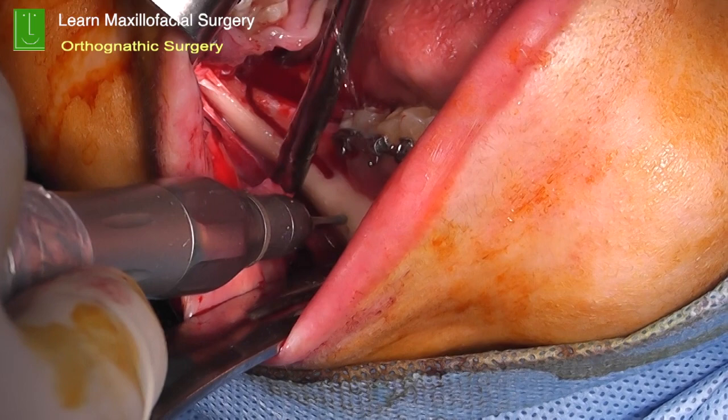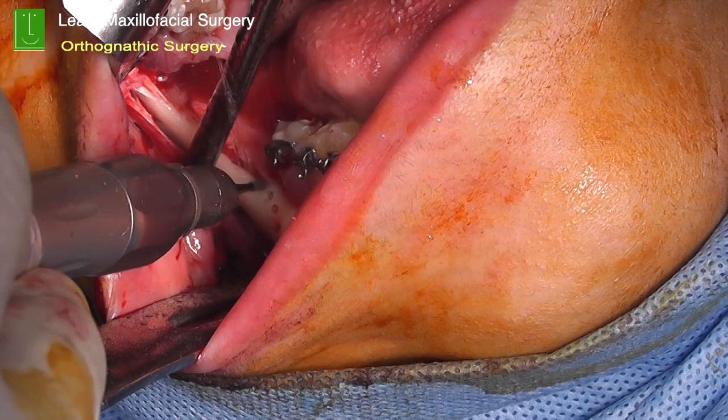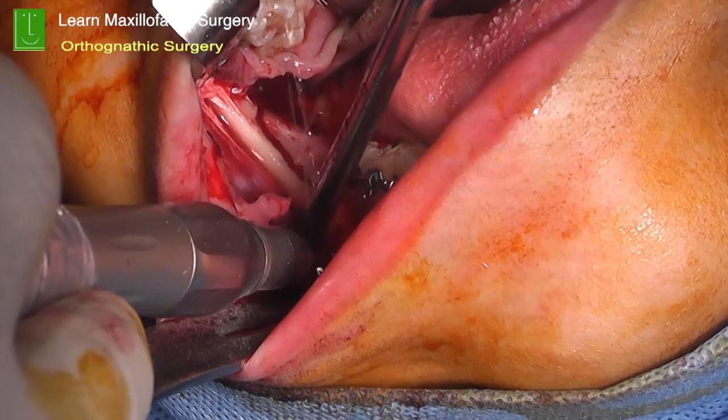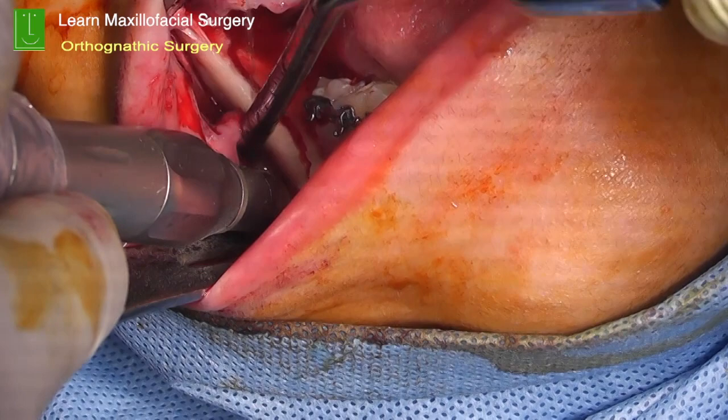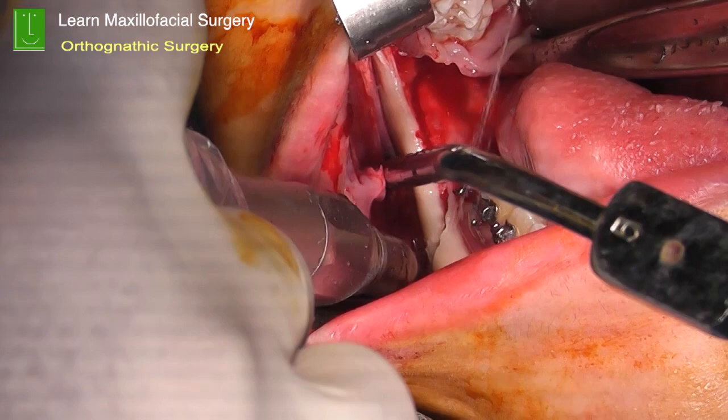Very important, you go through the cortical bone, and again you can see the way in which we're doing the postage stamp method. A fine drill is basically used, an 8 or 10 number drill you can use, and that should be taken to the full length of the working bit of the drill, usually about 7 millimeters. So you're basically going through the cortical bone, and thereby you are able to get into the cancellous bone. The moment the drill reaches the cancellous bone, you will invariably get a bit of bleeding, and that indicates that you're at the right depth.